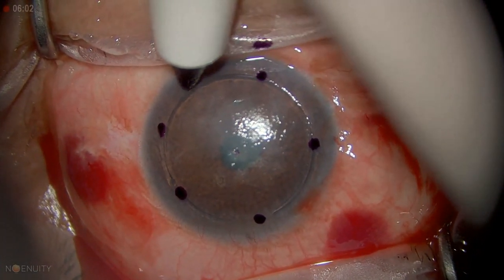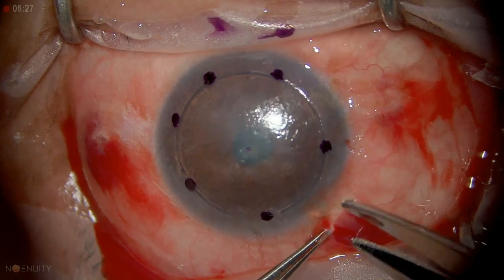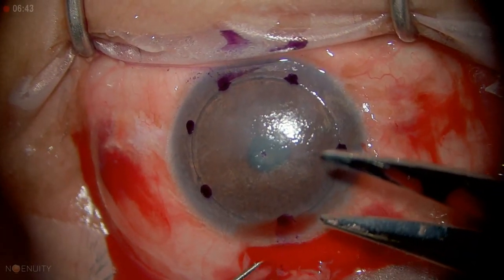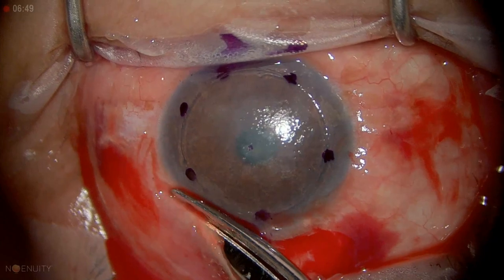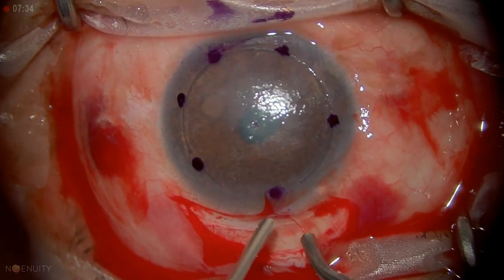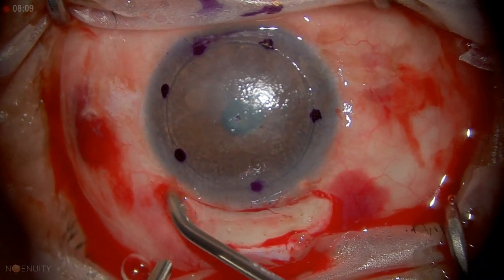There are different ways to do DALK. The most popular way is the big bubble, where you do some partial trepanation and then inject air into it. The way I learned is called the Mellis technique, and it serves me well. You can still perforate, and you don't get bare Descemet's membrane, but you get good results. What we do in this technique is create a scleral tunnel and burrow into clear cornea, then do a lamellar dissection.